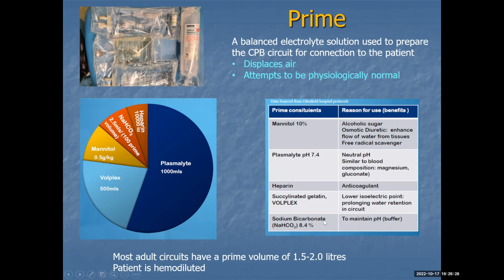And again, some centres choose to use this, some don't. We try to prevent being acidotic, so we do add a small amount.